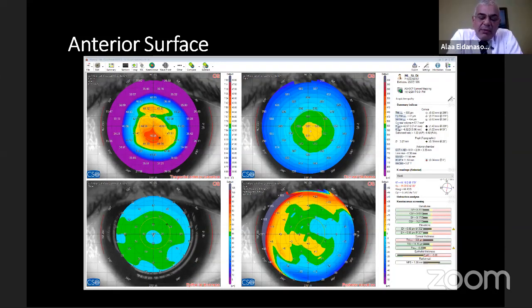Well, my answer would be, any keratoconus screening, whether on the Sirius or the MS39 or the Pentacam or the Galilei or the OPD scan or anything, would be just a helping tool to the surgeon, but none of them will ever be 100% accurate. You can never ever rely on keratoconus screening. But what I can say is that with the MS39, the available keratoconus screening is very helpful, and I know that it will become much more helpful in the very near future.